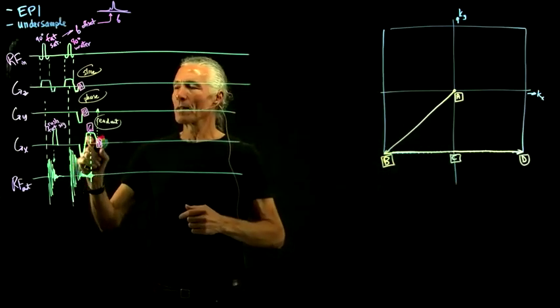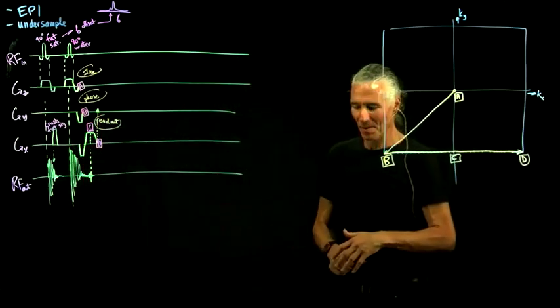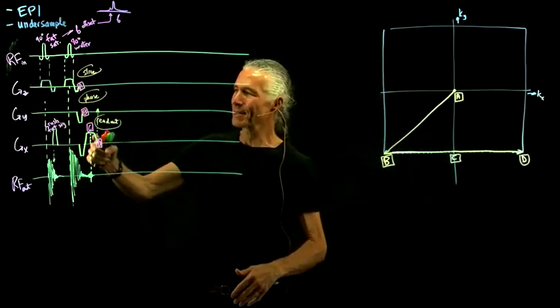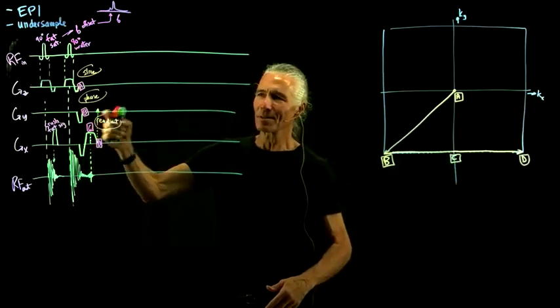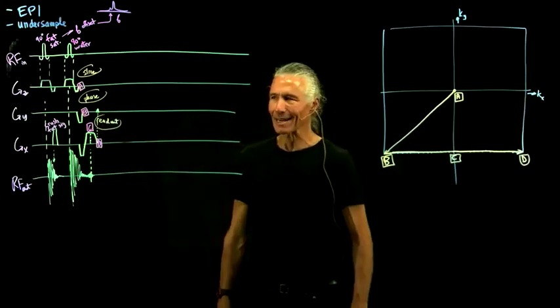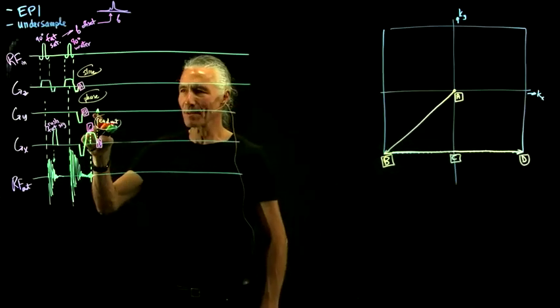We'll take a trip over to the MRI center and turn on the magnet so you can hear some of these things. If you turn that gradient off and just listen, then you just hear the blips. The blips are just little tiny sounds because it's not much of a gradient.